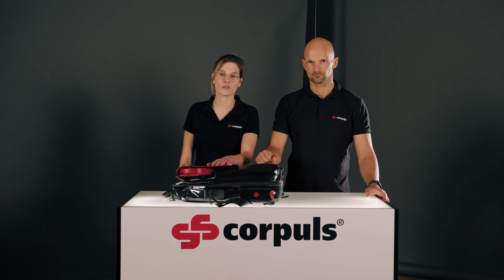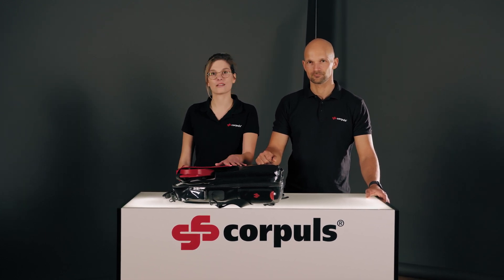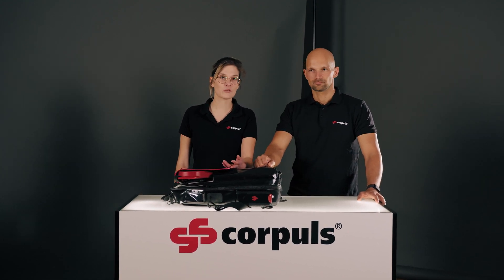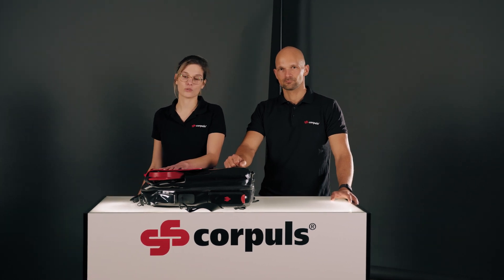Today we want to give you a brief overview of the corpuls cpr. We'll start with the different contents in the bags and then move on to the operating controls that we find on the device itself. Then we'll move on to the energy management and finish with the different boards.